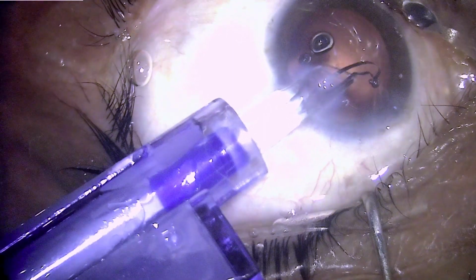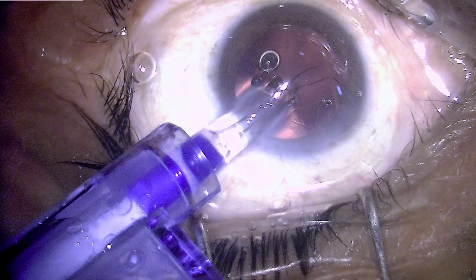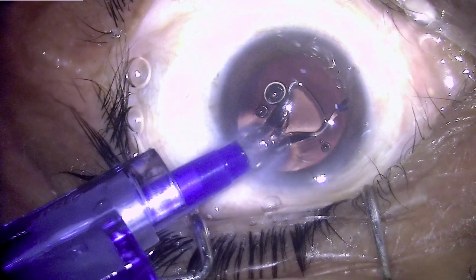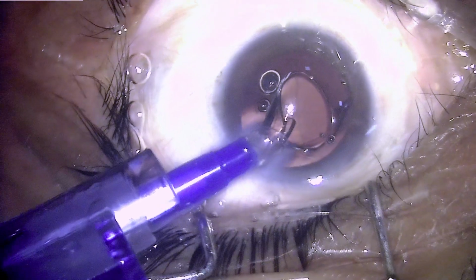Now it may be a controversial point that why a single piece IOL is being implanted into the sulcus, but that is something which we can discuss some other day. However, I have found that these IOLs are tolerated well in the eye and they are centered well.